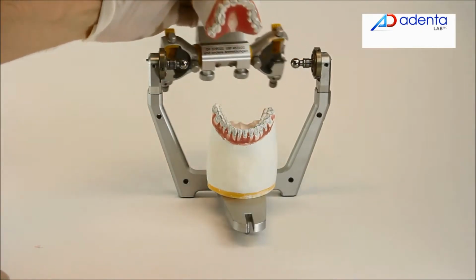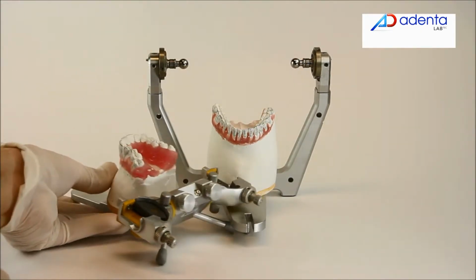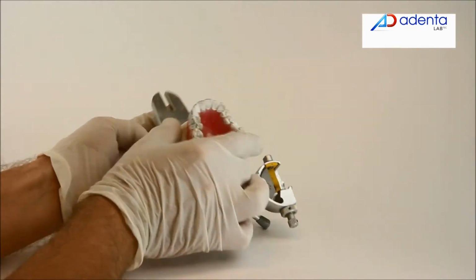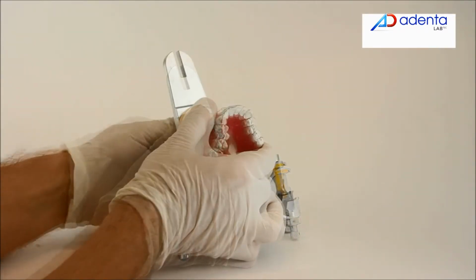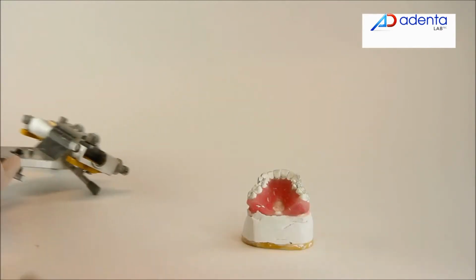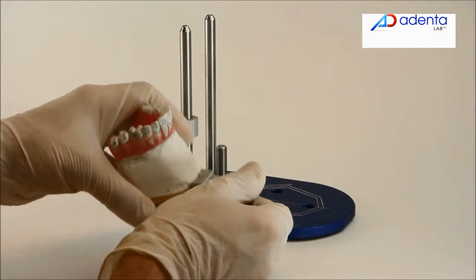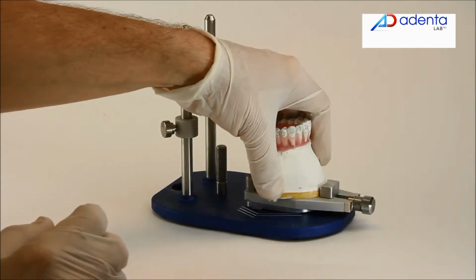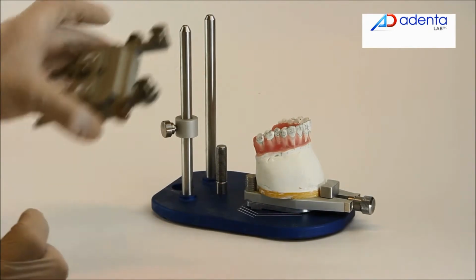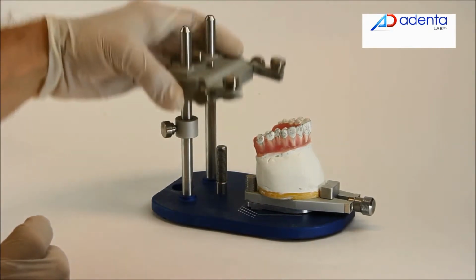Repeat the whole process with the upper model. Place the upper model into the occlusal plane reference with its plate. Put the model onto the model fixation and adjust the acrylic plate with the upper VTO to the occlusal plane of the model.